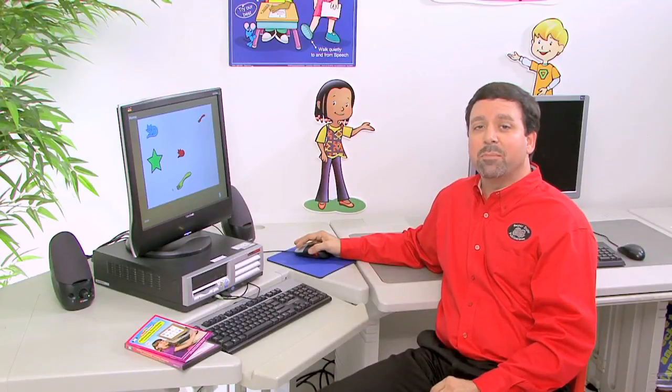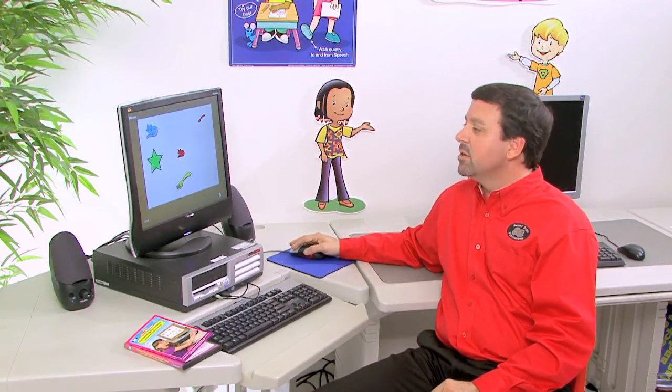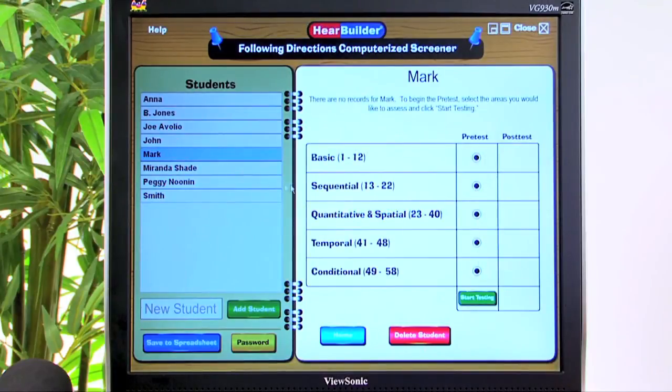So those are a few examples of the basic directions. So let's go back to the home screen, and now let's take a look at some examples from the Sequential Directions subtest.